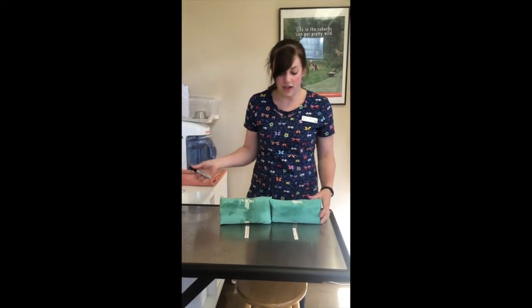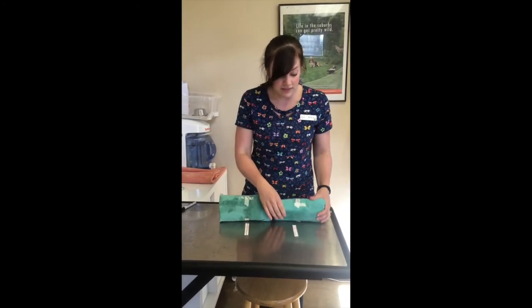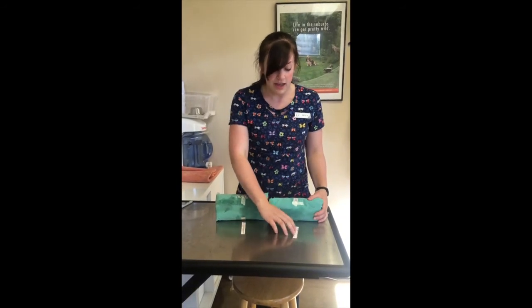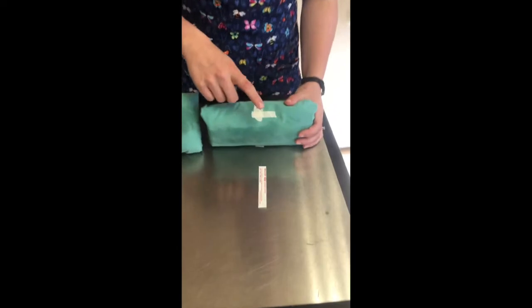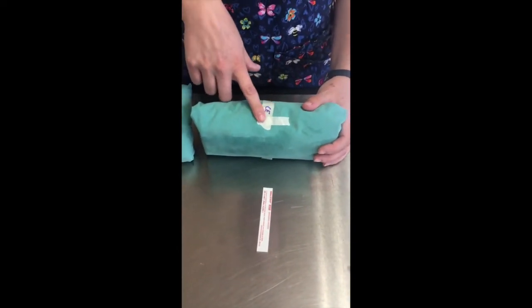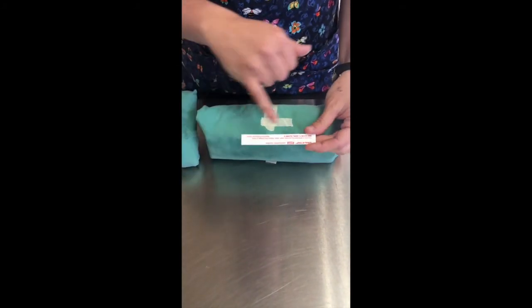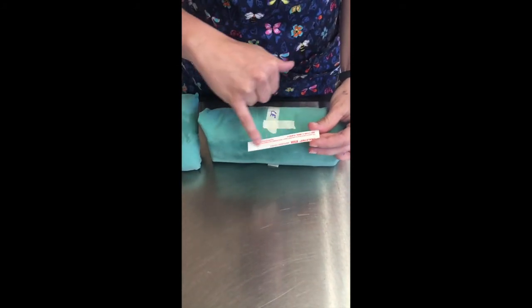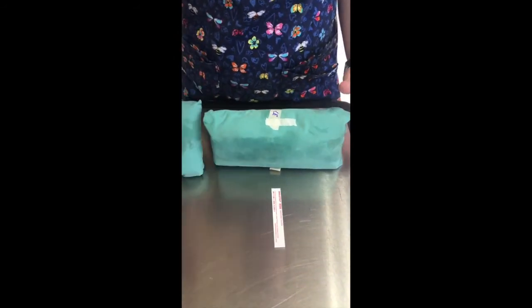Okay, so the ways you can tell whether the pack has been sterilized or not: you can see that this pack has not gone through the autoclave. It has not been sterilized. You can see the indicator tape on the outside has white lines on it. That's our first indicator that this has not been sterilized. If you were to open this pack, you would find an indicator strip with a yellow line through it, and that also indicates that this has not been autoclaved.